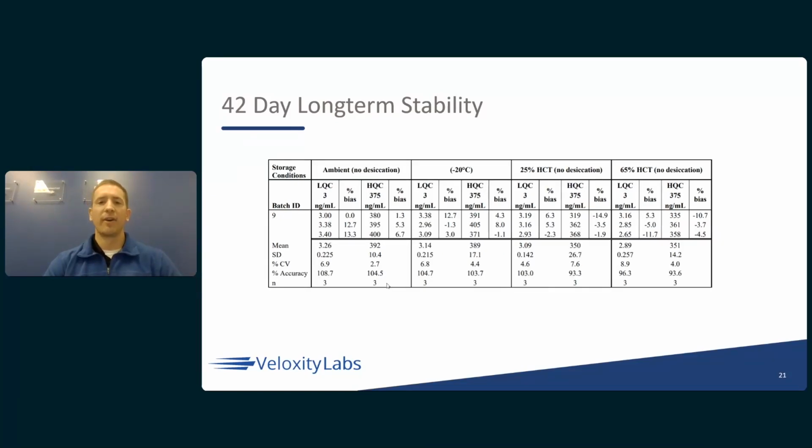And then the long-term stability. So this was very helpful to us. We did LTS, one LTS time point with hematocrit bias, and then once again, just under freezer and ambient. This allowed us to then store the samples for a longer period of time, and the LTS is ongoing here as well. Compound is very stable for 42 days, just at room temperature.